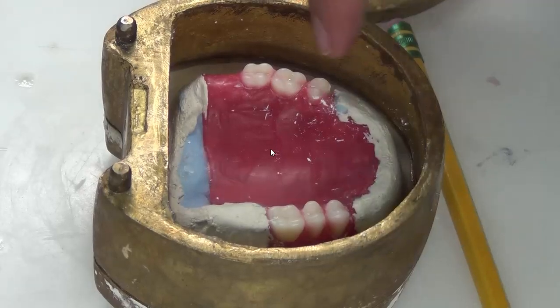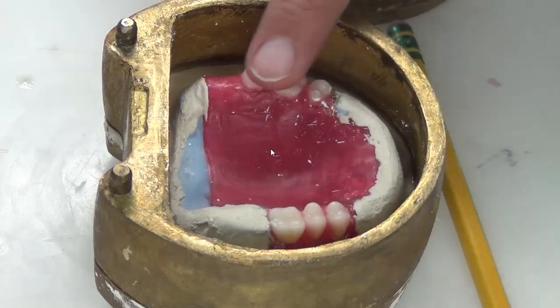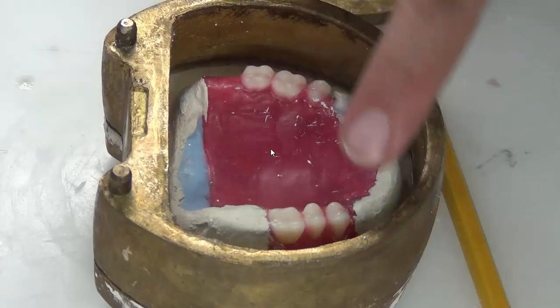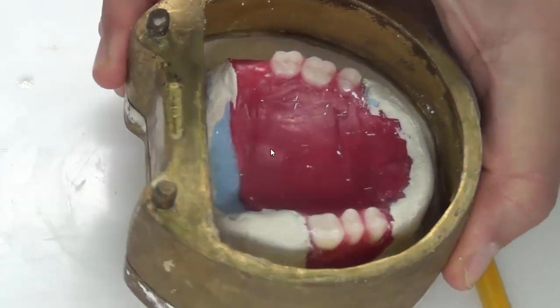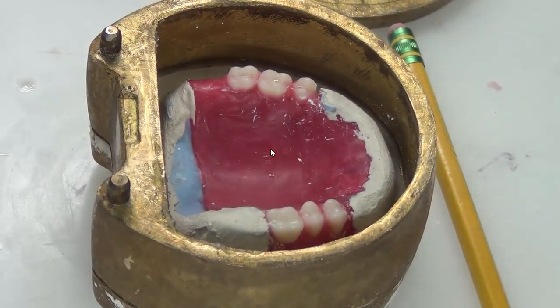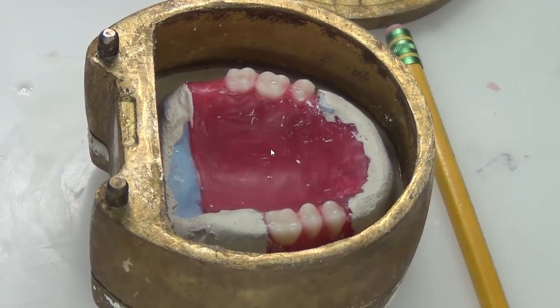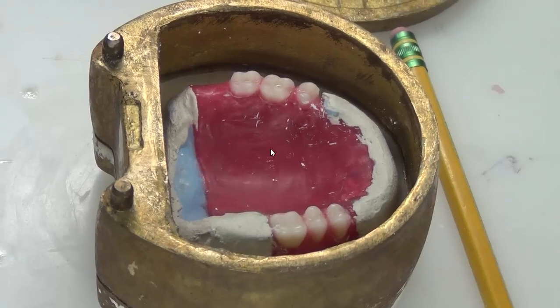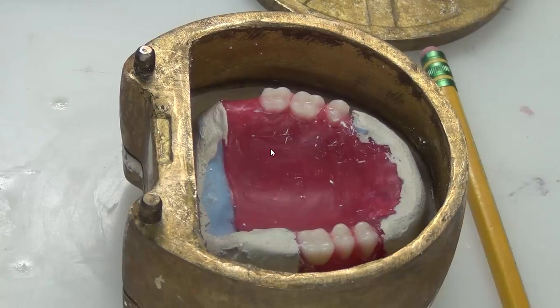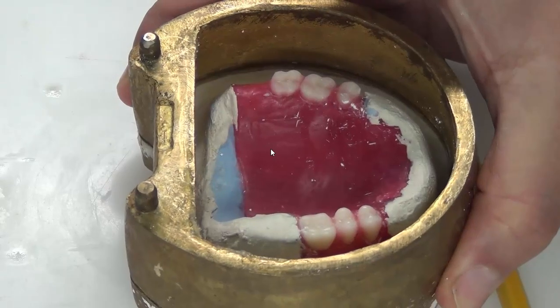And then we're going to add the second layer, which is stone, regular stone, up to the level of the artificial teeth. We're not going to go to the full length. We're going to stop at the level of the teeth. We're going to use the vibrating table while we're adding the mix of the stone, because we want to make sure there are no bubbles. The vibration increases the flow of the plaster. It adapts to all surfaces around the teeth and the wax, and it will eliminate any bubbles in between the layers, okay? So we're at this step where we're adding the second layer of stone.